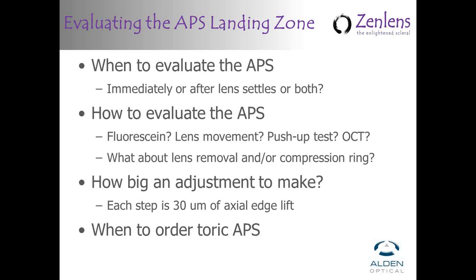Sure. I think that when I put a lens on a patient's eye, I am going to immediately look at the lens just for any gross problems that immediately tell me this lens is absolutely way too shallow or way too deep, so that I don't waste time letting a lens settle that has absolutely no hope of fitting. But if the initial impression immediately out of the gate is that the lens looks reasonable, then I want to give it some time to sit. Typically, I'm going to wait about 5 or 10 minutes, and I'm going to reassess the fit.